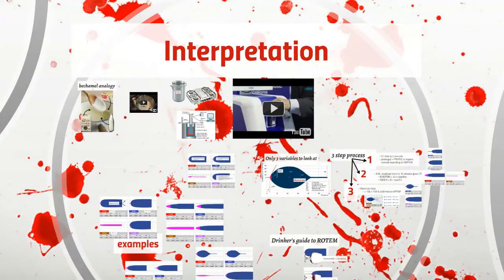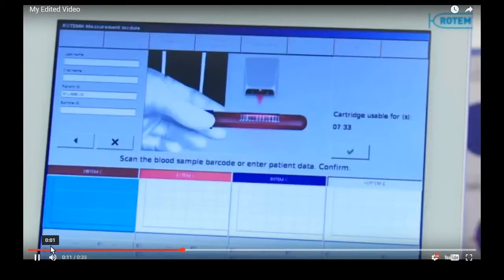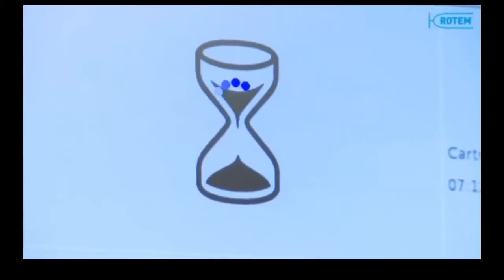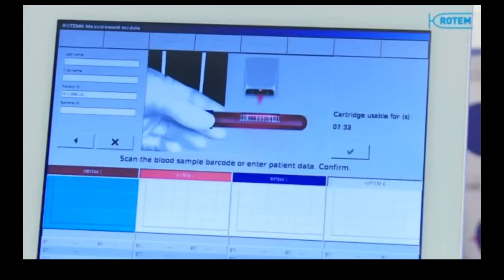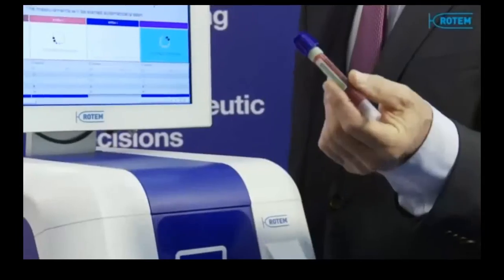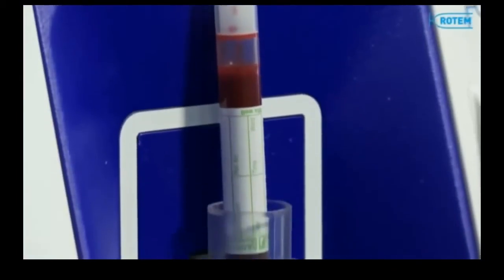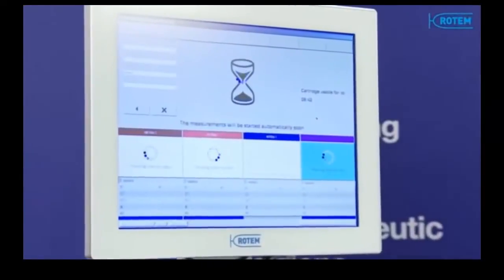So let's talk about actually running a test. It's really quite remarkably easy. You just get a cartridge, you put it into the front of the machine, and it does its thing. You take a blue citrated tube, just a regular blue INR tube, and then you put it into that cartridge. It's got a little pin in it. And then it runs wherever you like, in, say, recovery or your lab, and you can actually see the results live in real time happening in your theatre or wherever you are.